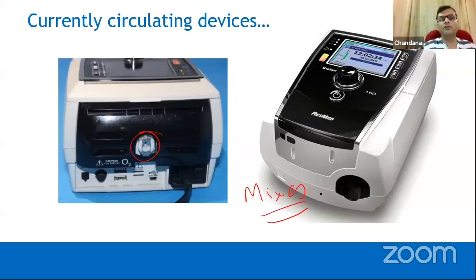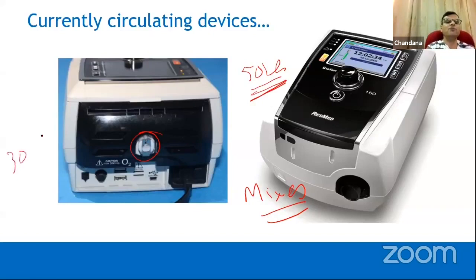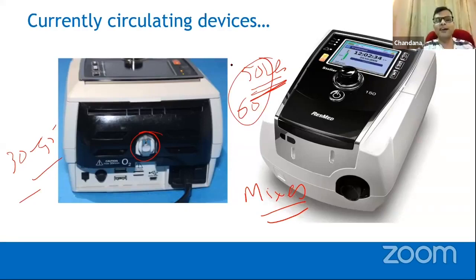It has a turbine. So when the patient breathes with, we'll say, a peak flow of 50 liters per minute, which is a dyspneic patient, normally peak flow is 30 to 45, but generally it can be 50, 60. When the patient tries to breathe harder, that generally is about 70, 80 liters, but dyspneic patients are generally about 50, 60, because that is the flow we can provide with high flow. So if the ventilator cannot provide this high flow rate, you cannot give 100% oxygen.